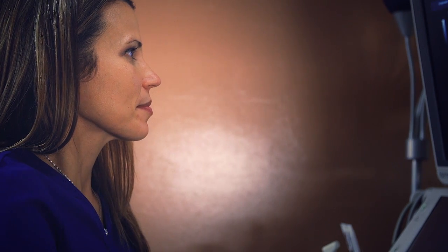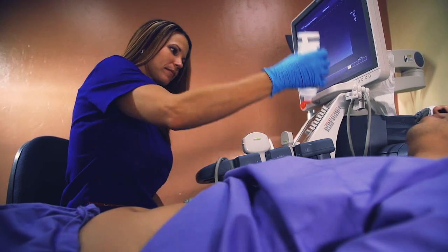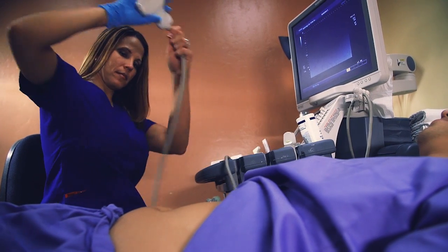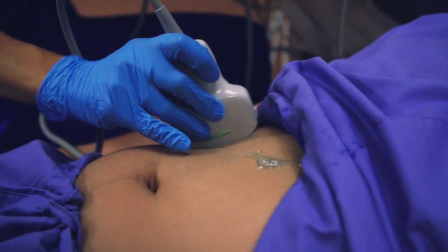Your ultrasound examination will be performed by a sonographer, which is a technologist trained in ultrasound imaging. The sonographer will apply a hypoallergenic water-soluble gel to prevent air from getting between your skin and the transducer, which is a small probe resembling a bar of soap.